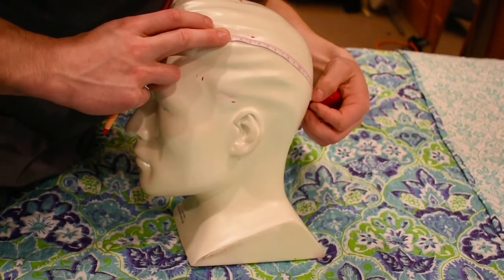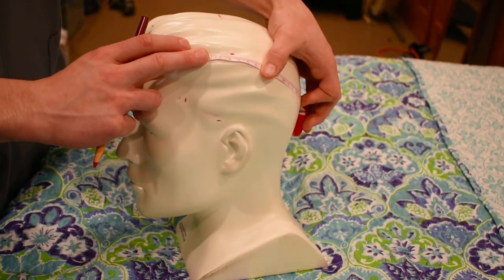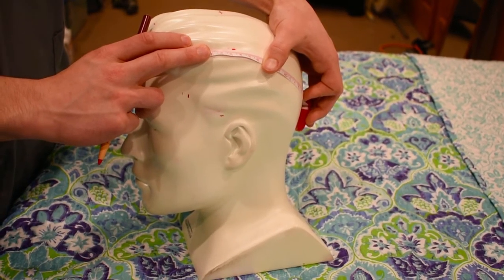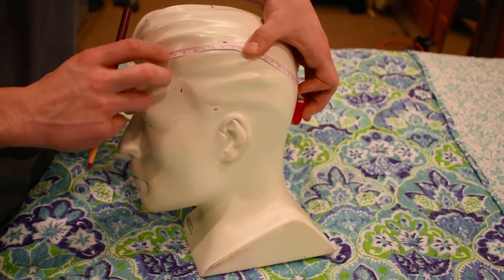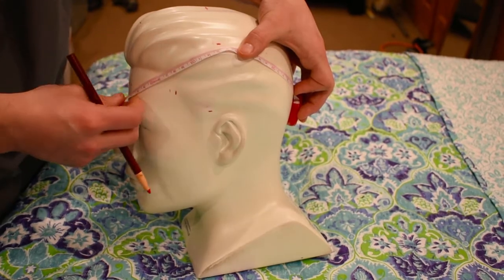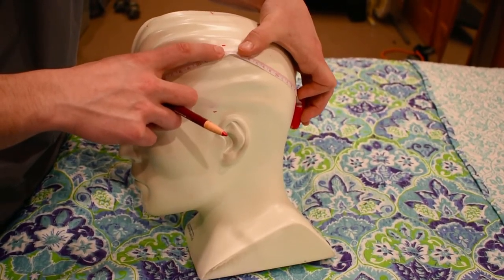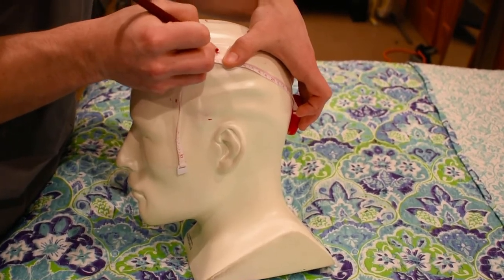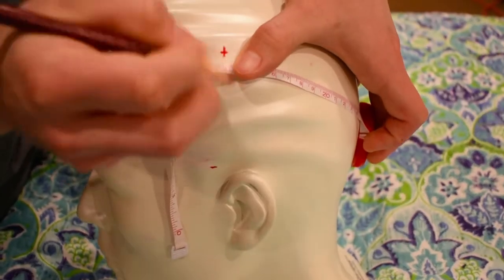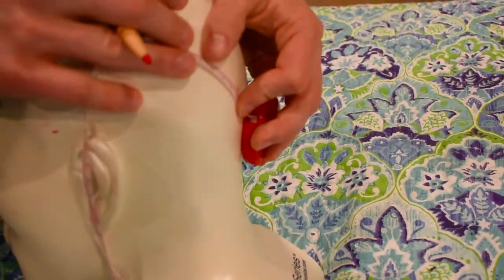We get 26 centimeters, not inches, I apologize. So what we're going to do is measure halfway between, which would be 13. Right here at 13, we're going to make our mark, and that's going to complete our marking for C3. And then at 26, we're going to make a mark.